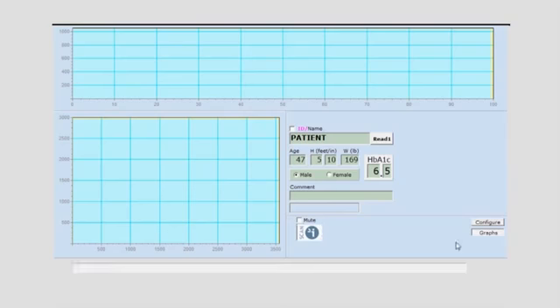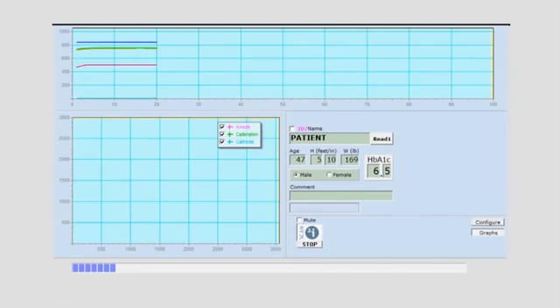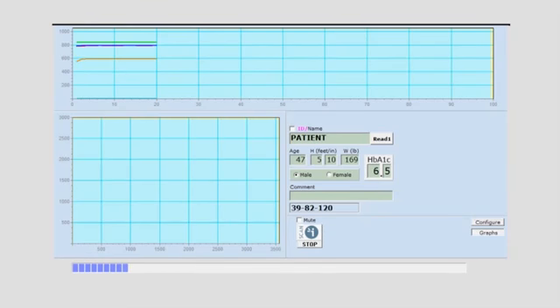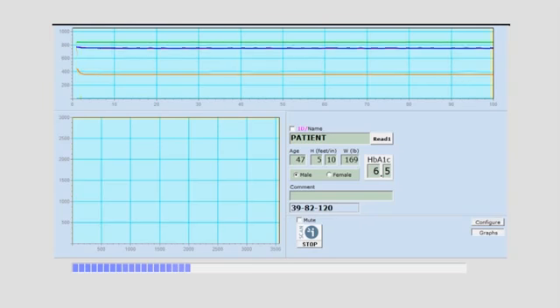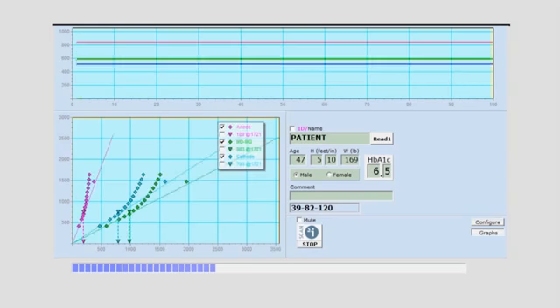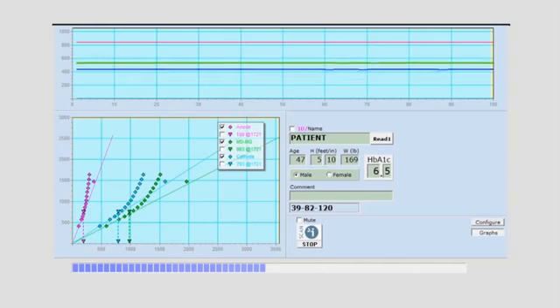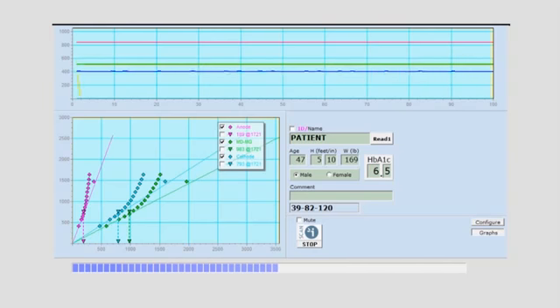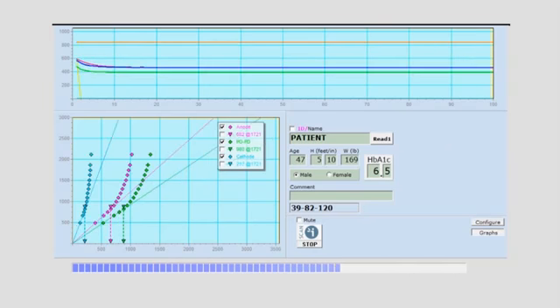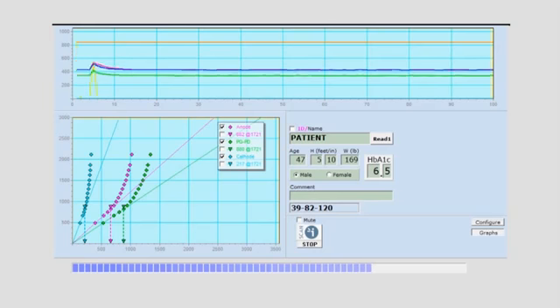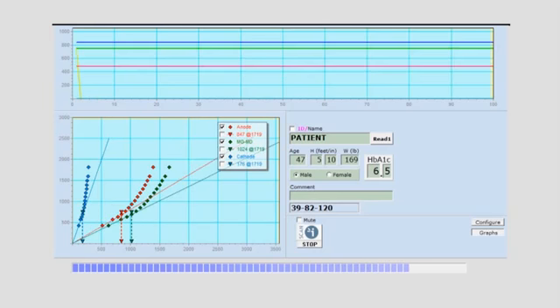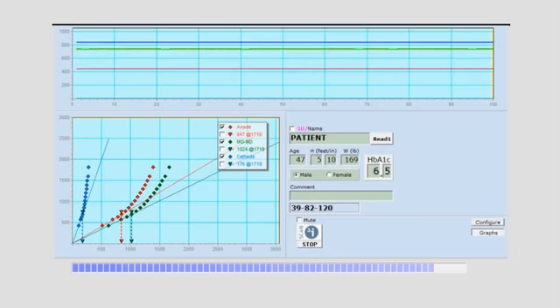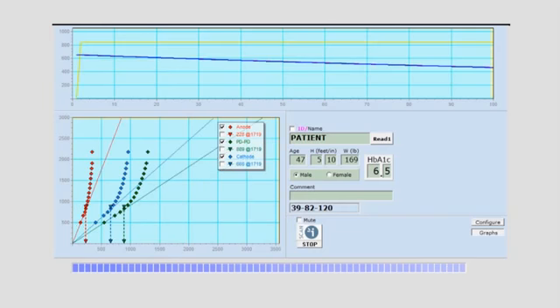The chloride ions from the sweat glands are attracted to the stainless steel plates. The chloride conductance is quantified and acts as a biomarker to assess sweat gland function in relation to small nerve structure. SudoScan can distinguish between asymmetric and symmetric small nerve fiber damage by swapping electrode polarity during scanning, thus allowing SudoScan to differentiate between an isolated unilateral peripheral neuropathy and a peripheral autonomic neuropathy.